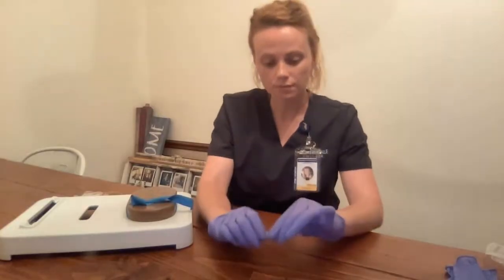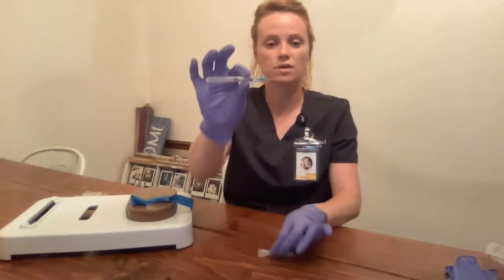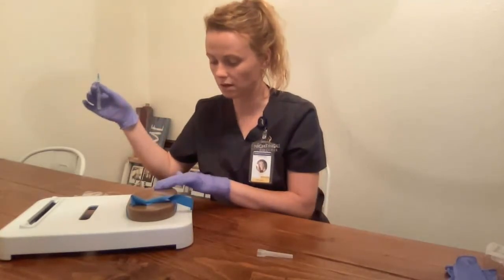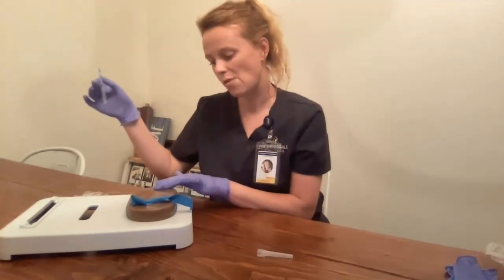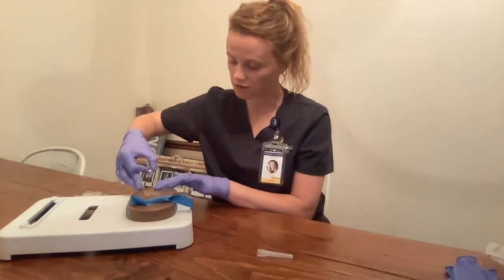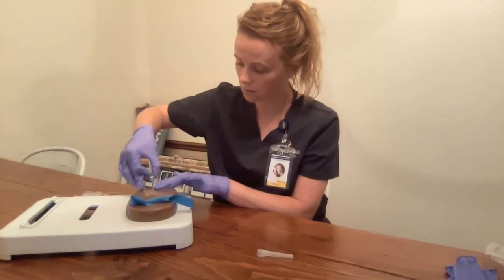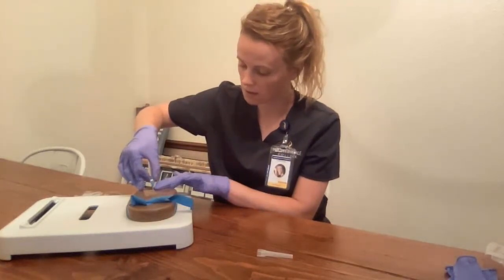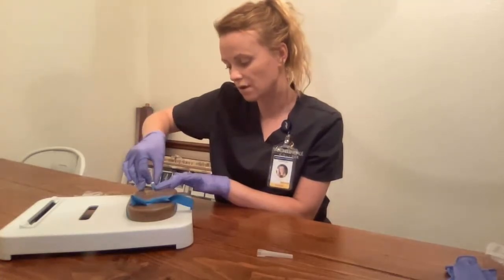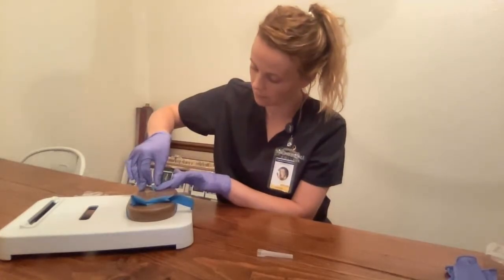I'm going to get my needle. When inserting the needle in the patient, I want to ensure that it is beveled up. I'm then going to come here with my middle finger and anchor the vein about 1 inch below the insertion site. I'm going to go in at about a 30-degree angle. I'm going to observe for flashback. I see flashback. I'm then going to level out and advance further about 1/4 of an inch.